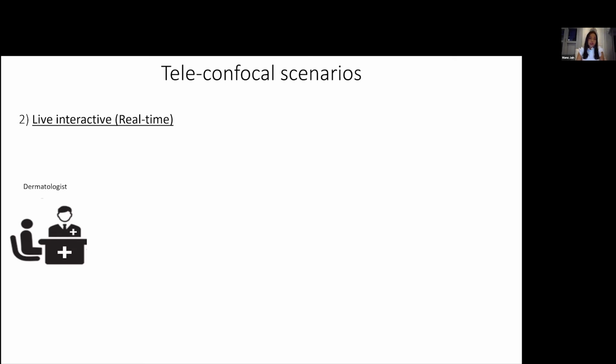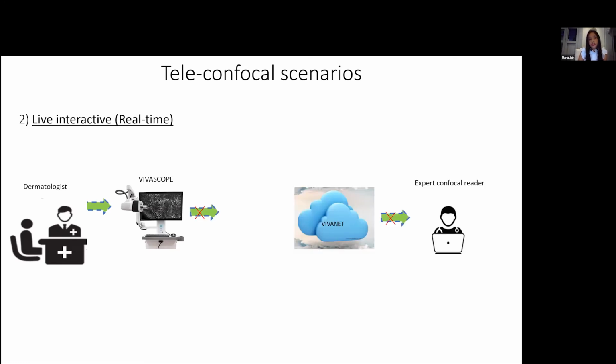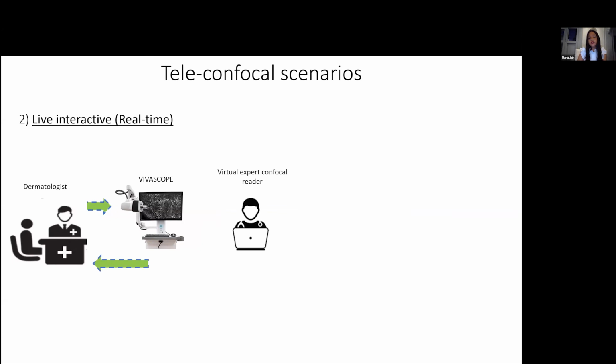In this scenario, which we are testing, we have a dermatologist, and the dermatologist schedules a patient for a confocal session. No images are sent through the cloud; instead, the expert is brought in through WebEx. The link is shared with the expert, like I'm giving a talk right now. And the expert will be with the dermatologist, can talk to the patient, and give a diagnosis at the bedside.